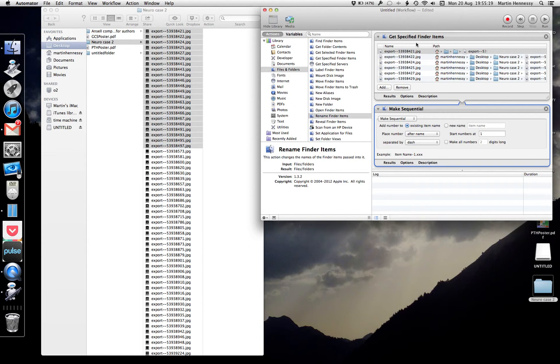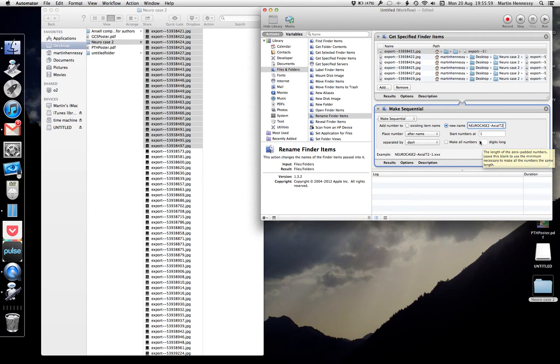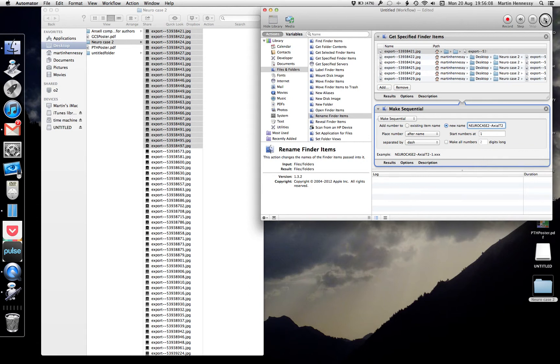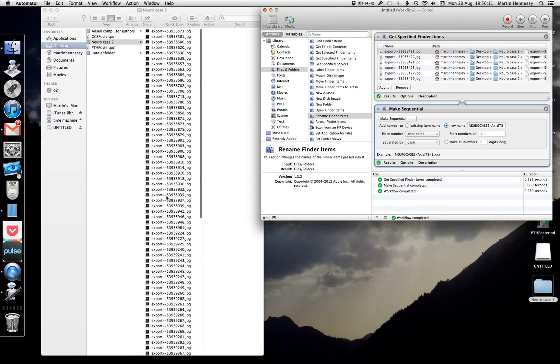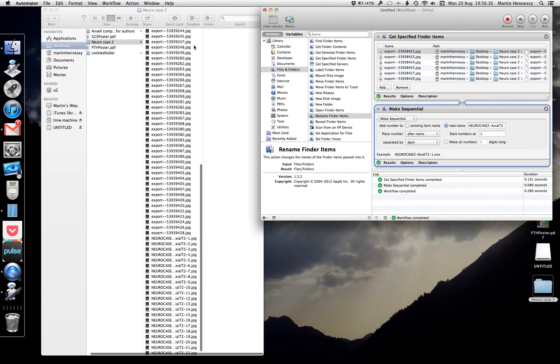It's very important that the files are in the correct order, which I've checked. They have to be in the right order because the sequential renaming depends on the order they are here, not the order they're supposed to be in. We're going to give them a new name — this is going to be 'neurocase2', but we need more than that: we need to identify this as a separate series, so we'll call it 'axial t2'. Make sure if there are fewer than 100 files you use two digits. Then hit Run — and they've all been renamed alphabetically.